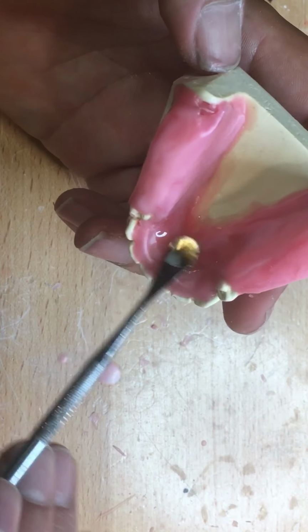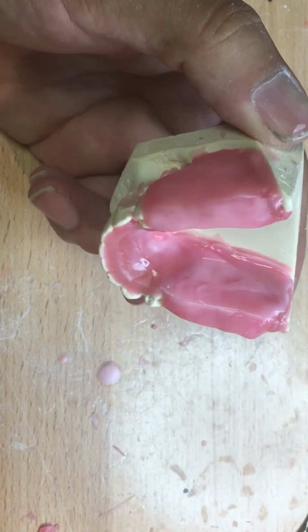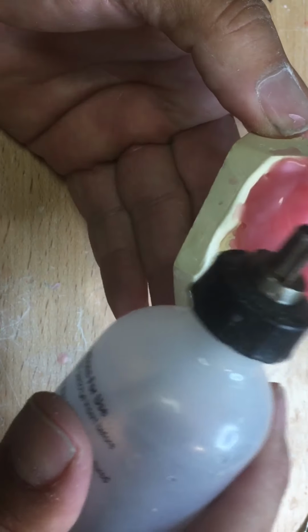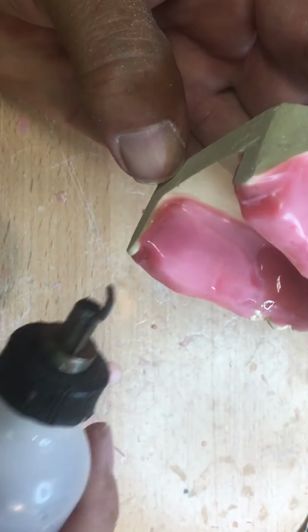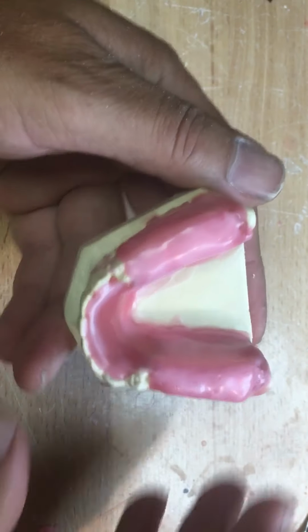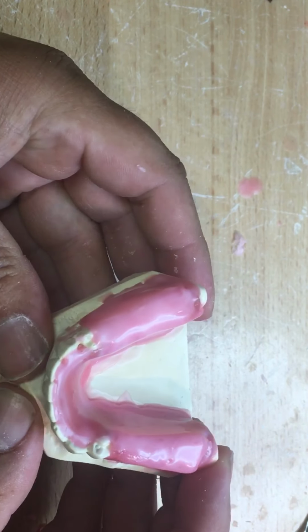There we go. Now, you can wait for this to harden. You can blow air on it, or put it in cold water if you're in a super rush. Or you can sit here and enjoy your coffee, talk to your neighbor. But you can see that this is about 8 to 10 millimeters.